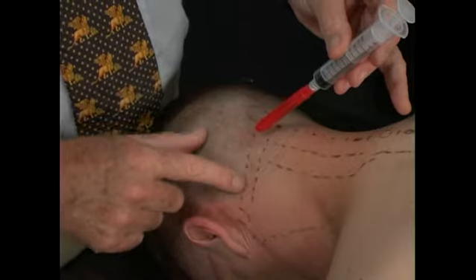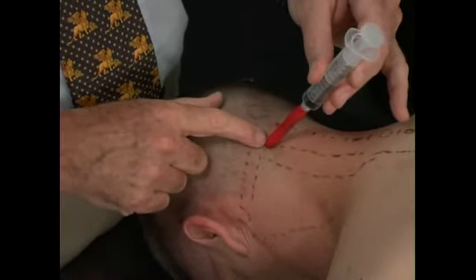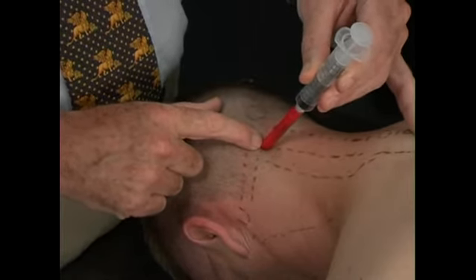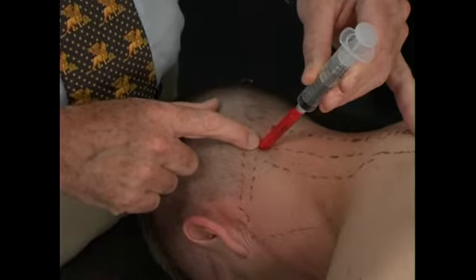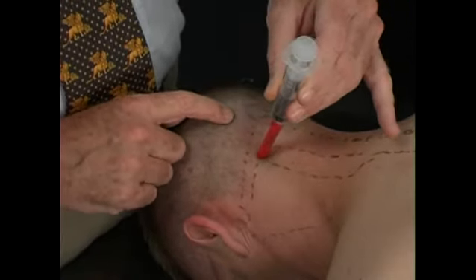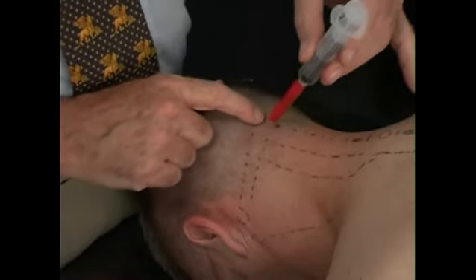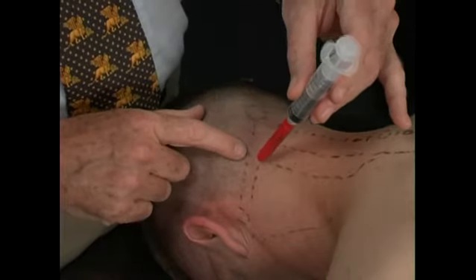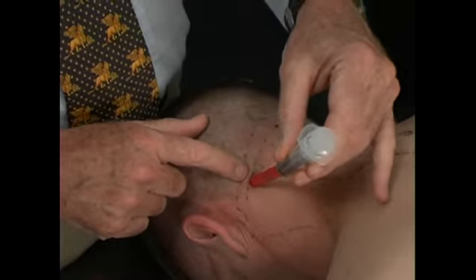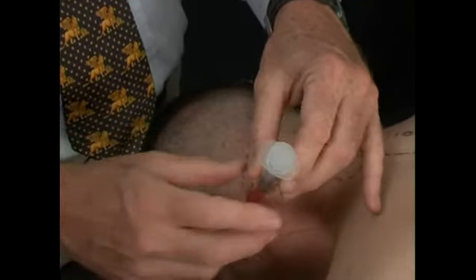After we've done the first line along the nuchal ridge, we then drop a centimeter or so down and aim back in again to go deeper into the splenius muscles. This is a very safe area of injection, and even if you tried, you probably couldn't get into the cord in here, but we do want to stay away from the midline with that needle. So we do our second row of injections into the deeper splenius muscles.